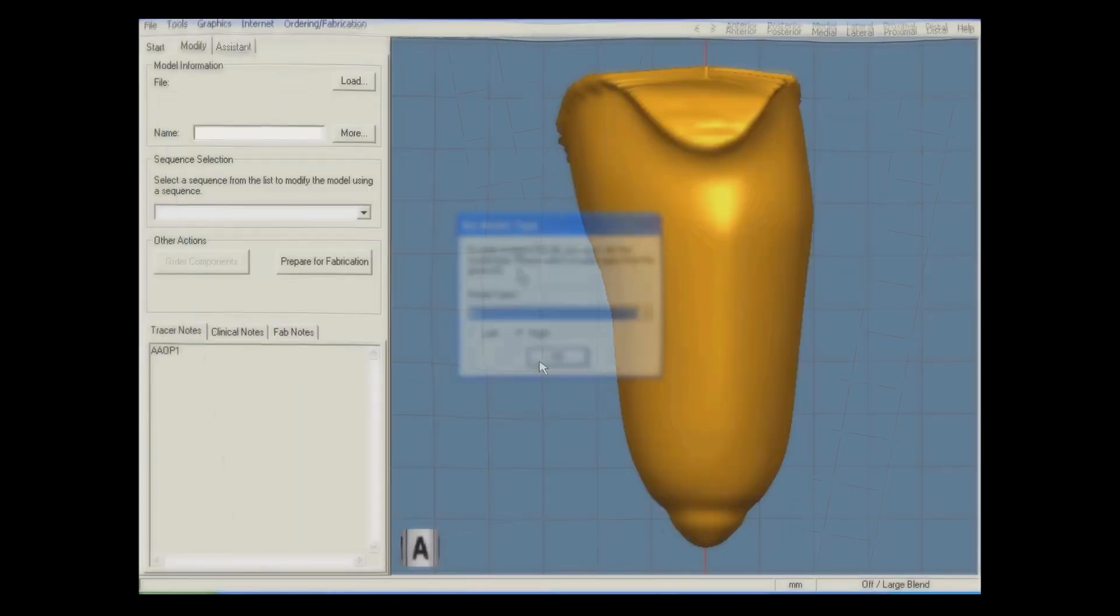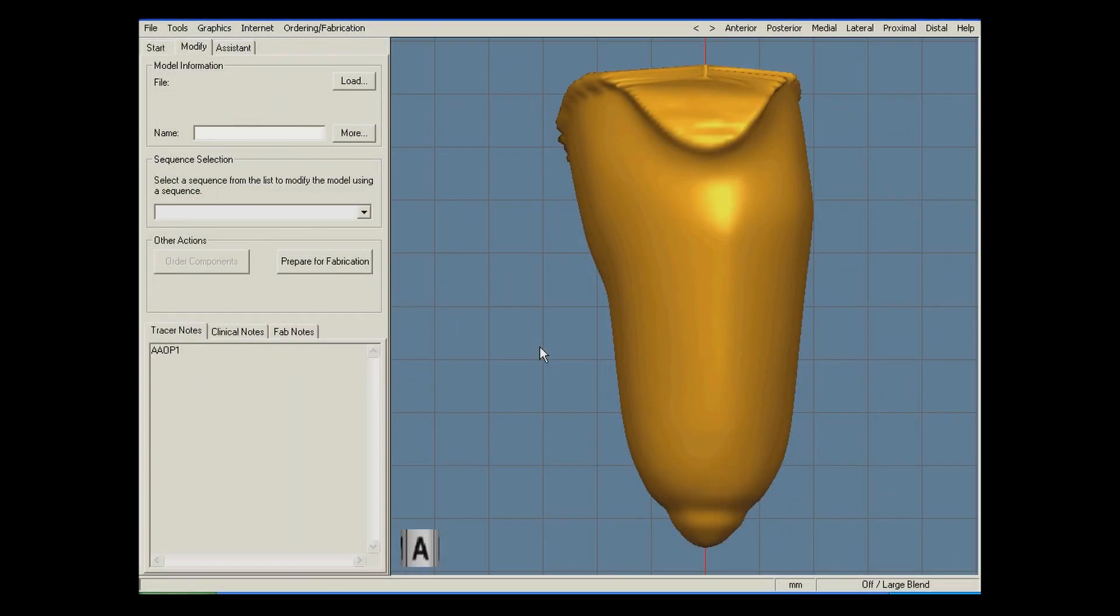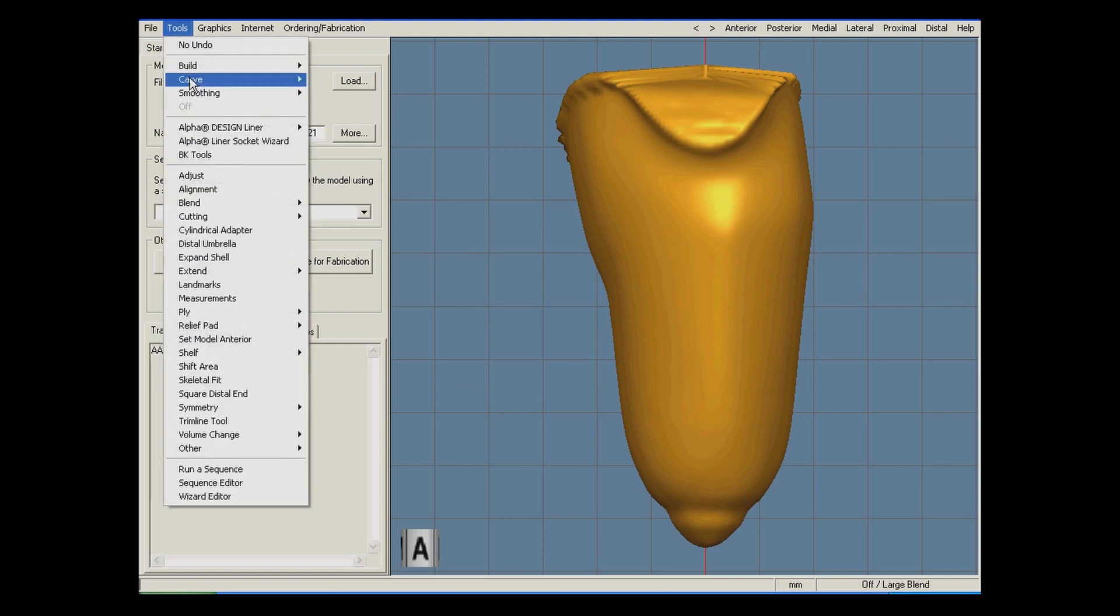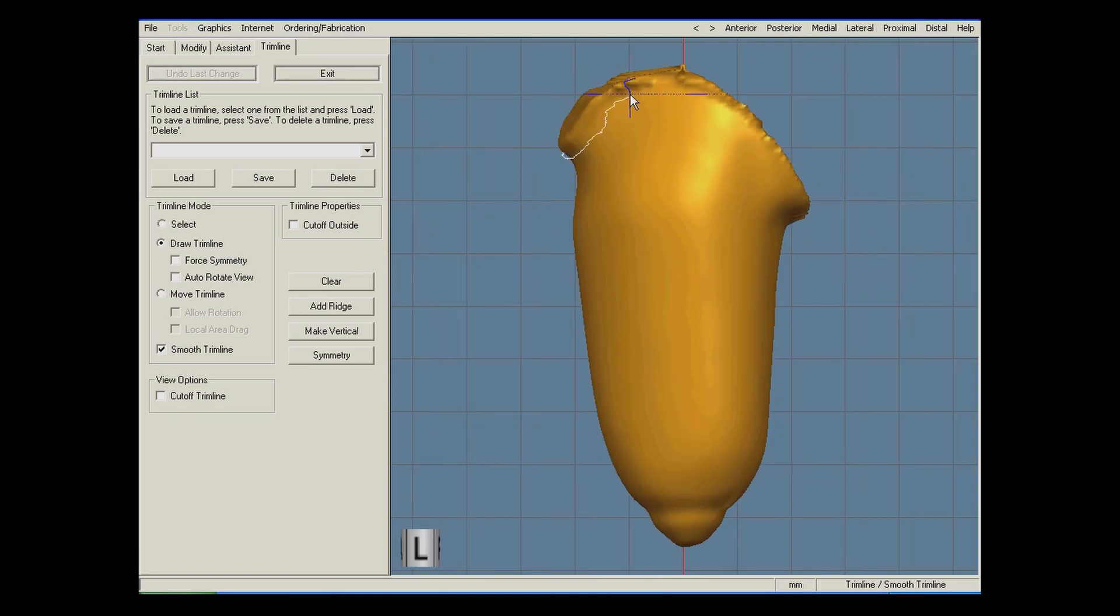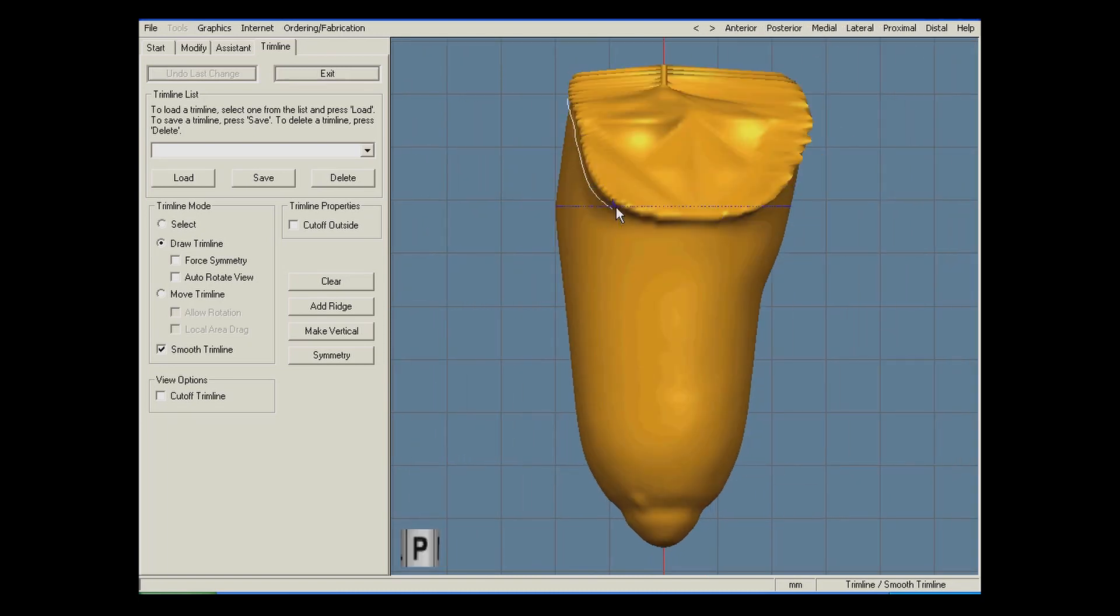First, I'm going to load in the scan. I will start modifying the socket by opening the proximal end using the trim line tool. With the mouse cursor, I make a rough outline of where the trim line should be.